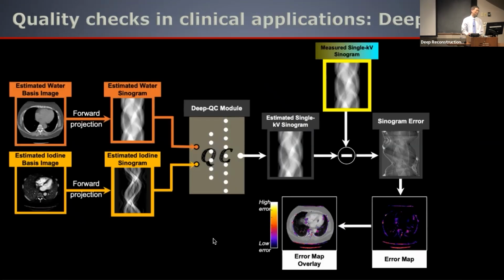Okay, in the last few minutes, I'm trying to tell you, okay, you have the model developed, everything looks good. Is our life just that, that's it? You just directly apply everything? Not quite. For all deep learning methods, that is at least my philosophy, we need to have a quality check in place, because you train, validate, and everything is good, but then you apply to a clinical setting. How do you know the future prospective clinical population will be the same as what you trained on? That is not good. We need to have QC in place.